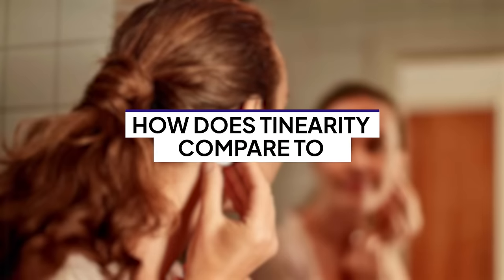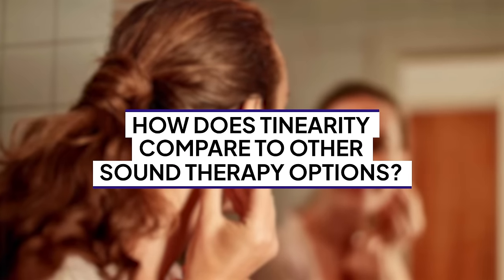Back to Tinearity — how does it compare to other sound therapy options? First, I don't expect the bone conduction adhesive to work too well. We want something sustainable and easy to use, and from my experience, that adhesive piece just won't hold the test of time. I would love to be proven wrong on this, because I'm always looking for my patients to have more sound therapy treatment options, but based on my experience, that's what I've seen.